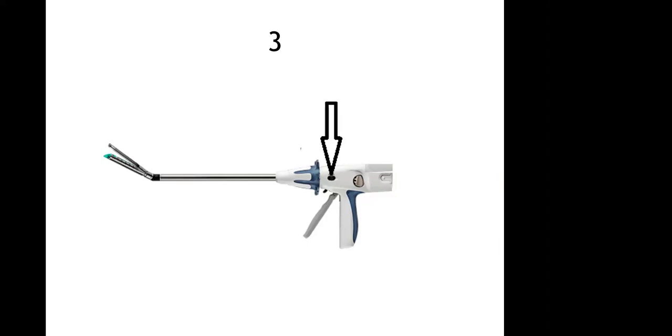Hemicolectomy, sir. No, in hemicolectomy you will have to transect the colon only. In sleeve gastrectomy, one of the bariatric procedures, since you have to cut a long length along the entire axis of the stomach, you use a powered stapler to minimize bleeding in the course of stapling and cutting. Okay.